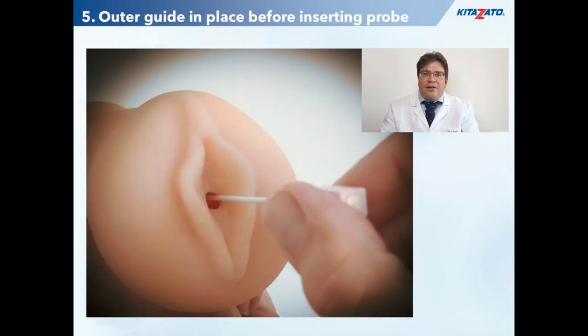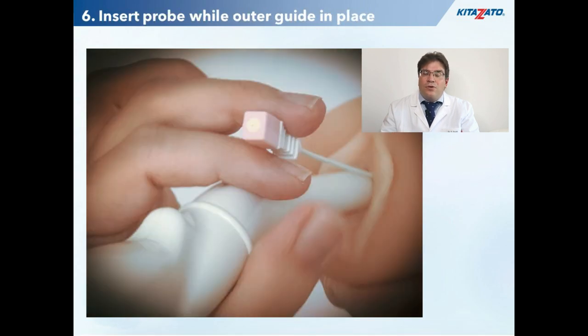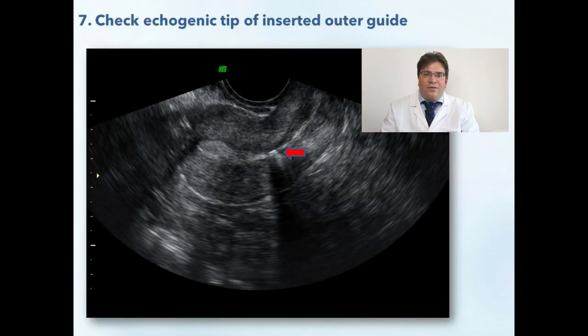You would reach this stage with the outer guide inserted into the cervix. Next, you have to introduce the vaginal ultrasound probe while maintaining the inserted outer guide above it — and not to the side or below — to facilitate the introduction of the inner catheter later. You could hold the proximal tip of the inserted outer guide between your middle and index fingers and keep the vaginal probe in a ring form with your index finger and thumb. At this position, you should check your endovaginal ultrasound image. It is important to obtain the best sagittal plane image possible to visualize the echogenic tip of the inserted outer guide and to make sure that the way is obstacle-free for the inner catheter to advance towards the fundus.